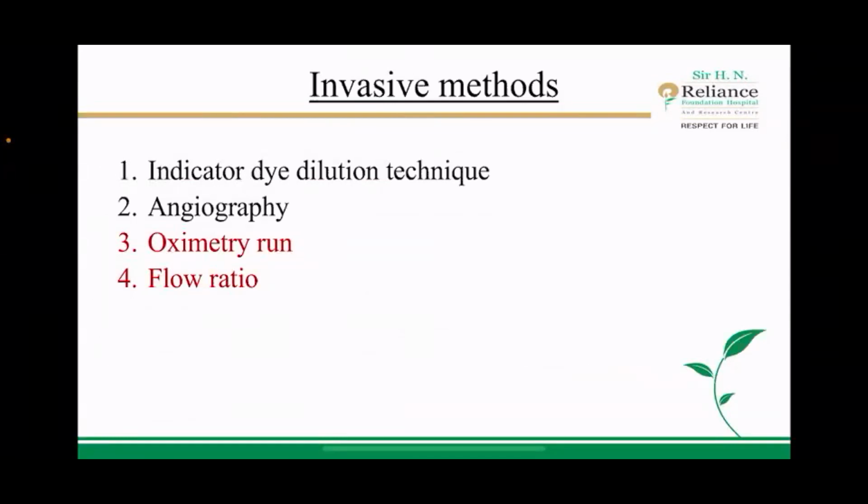Coming to the invasive methods, we'll be talking about 4 different methods. That is the indicator dye dilution technique, which is not routinely used. We'll just briefly go through it. Angiography, again, not that common. The main 2 are oximetry run and flow ratio.